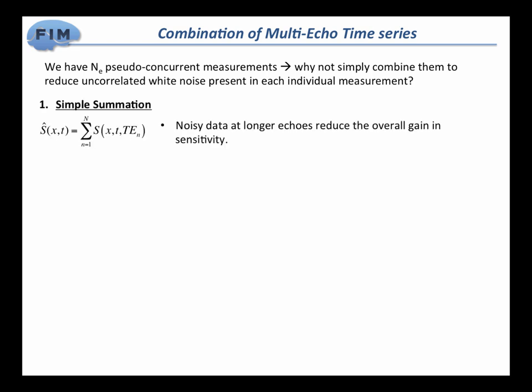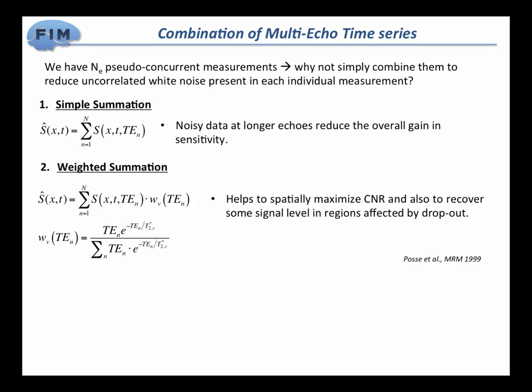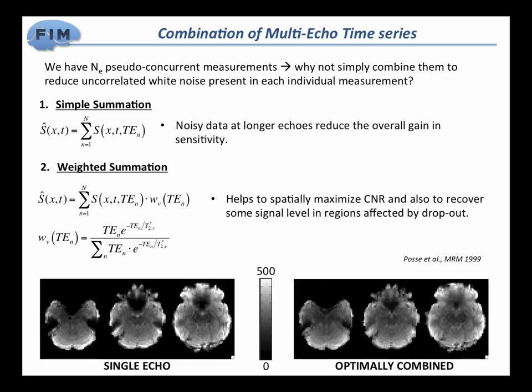You can think about just simply doing the summation of the echoes, or doing perhaps a little bit smarter way of doing this, which is a weighted average that is supposed to optimize for contrast. But the whole idea is that you have these 3 time series and you can combine them. This may be better than the other one in the sense that the math is much simpler, but also you have to think that whatever artifact is present in all of them, and things like motion are going to be present in all of them, here they're going to be still present in the average, okay? So it helps you with signal to noise in the sense that any random noise across them will go out, but maybe there are better ways to do this.